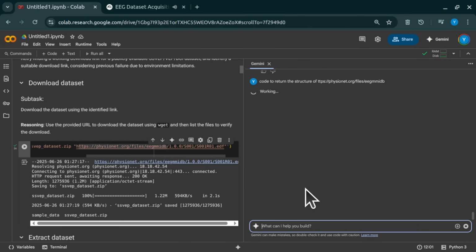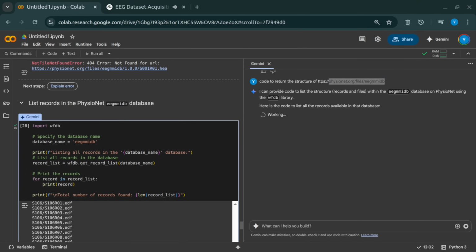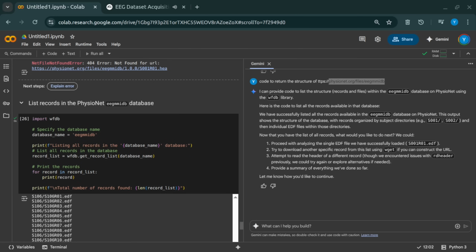But when we were thinking about visualization, we hit another one of those aha moments, didn't we, about choosing the right kind of visualization. We did. I mean, coming from general data analysis, my first instinct might be, I don't know, can we use a Venn diagram to group channels or something? But that doesn't really work for this kind of data, does it? Not for the raw time series data itself, no.